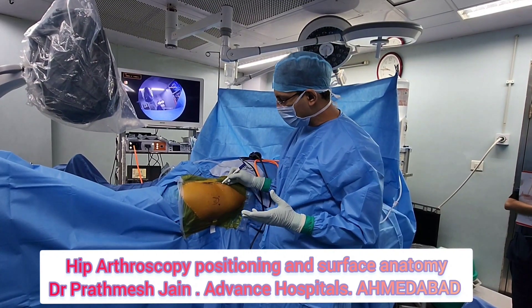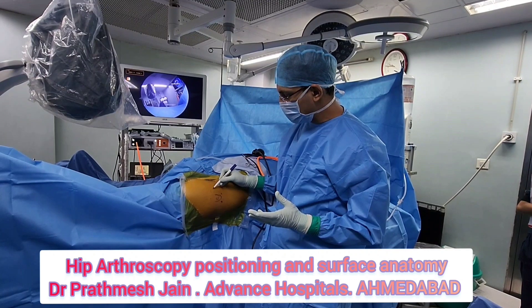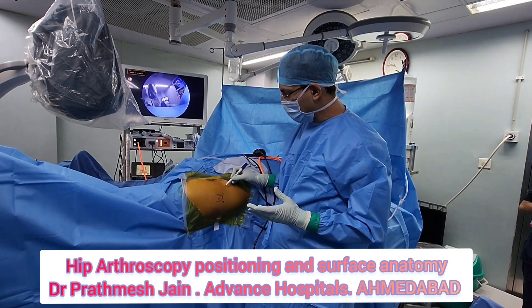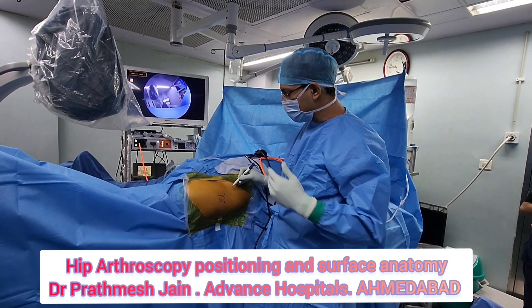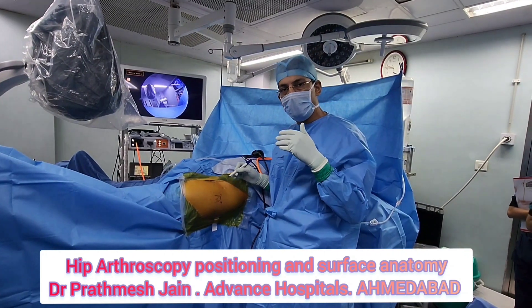For the peripheral compartment, you can use another portal called the mid-anterior portal, and one portal tangential to the femoral neck.